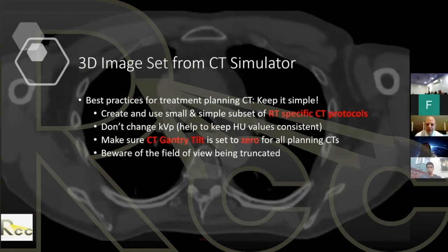So some best practices to keep in mind when we're doing a CT simulation: keep it simple. Moving on, there are best practices for treatment planning. Keep it simple. It's a good practice to create and use a small and simple subset of RT-specific CT protocols. Don't change the kVp from those. That helps keep the HU values consistent.